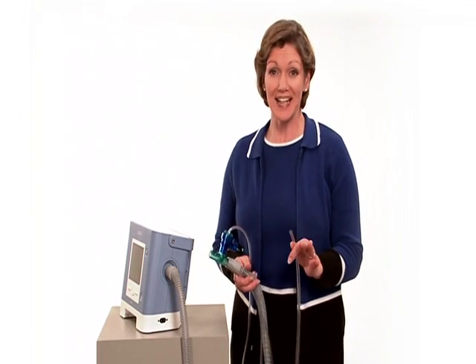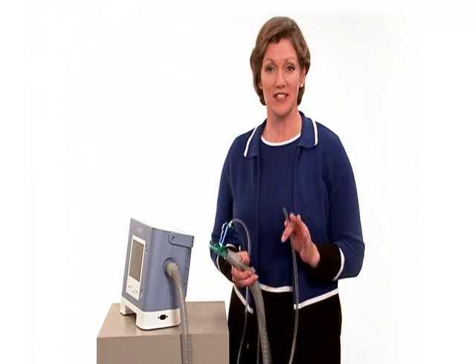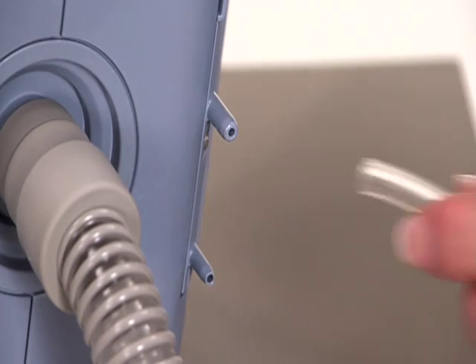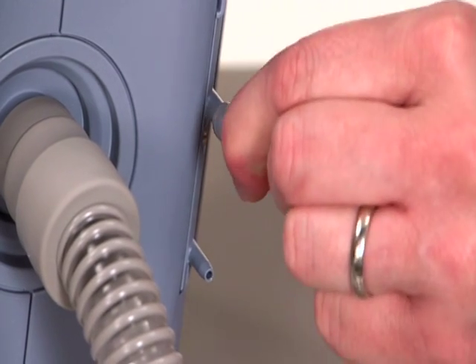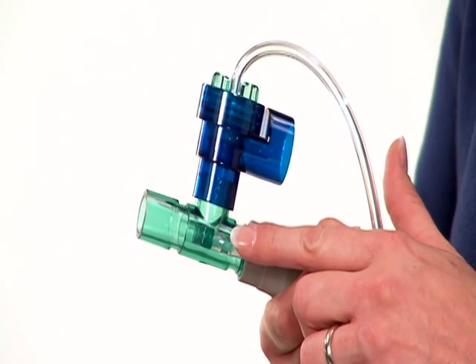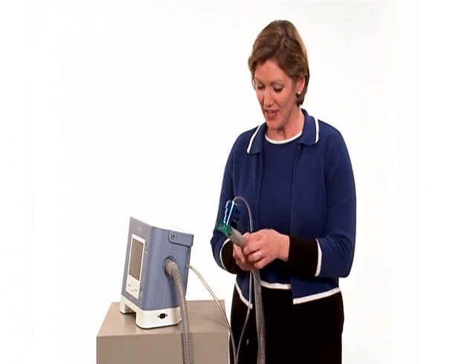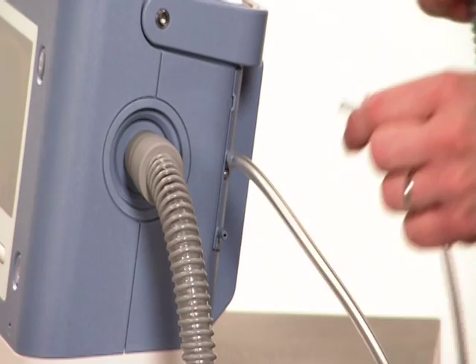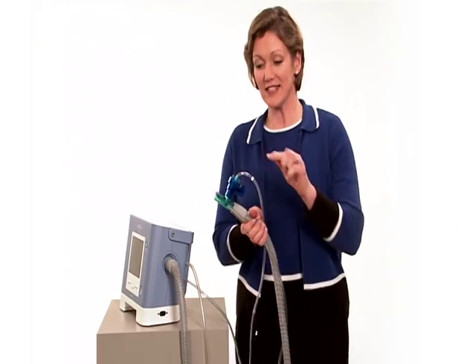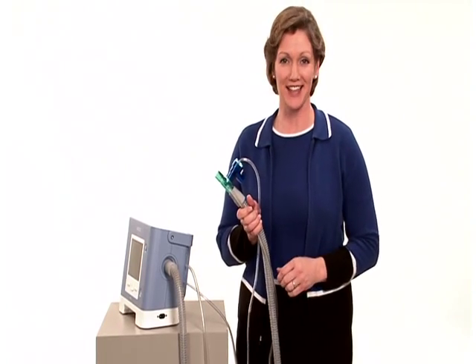If you're using an active system, there are 2 additional lines to connect, and you will have a different exhalation valve. The proximal pressure line attaches to the top connection on the active porting block. The other end of the tubing is attached to the proximal pressure port on the T connector. The exhalation valve control line fits onto the bottom port. The other end is connected to the top of the exhalation valve. The active circuit is now connected.